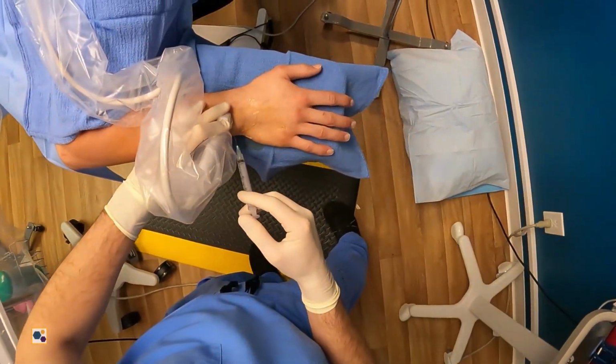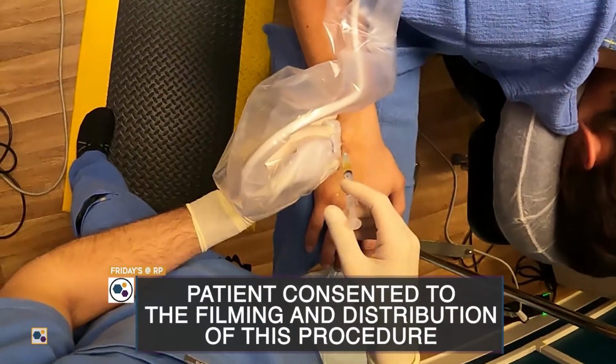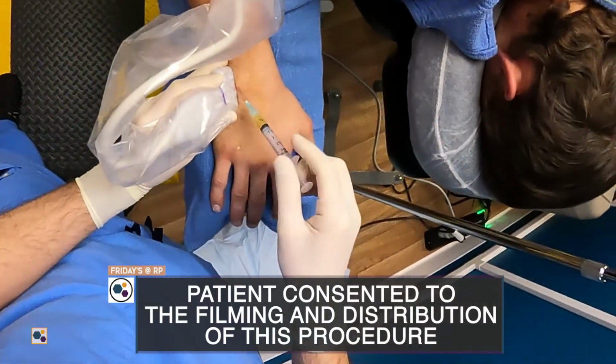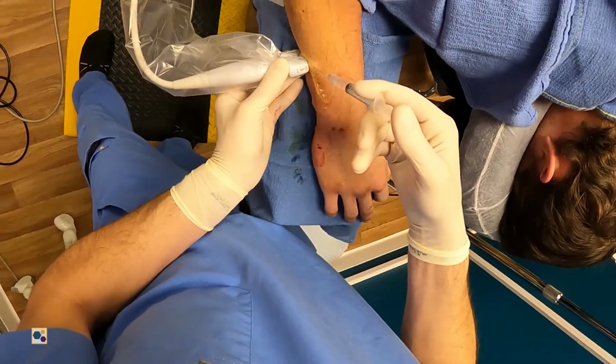And then lastly for him, he was having some right-sided wrist pain that actually was more of a traumatic injury. It's not more of a chronic degenerative thing, but he basically took a fastball right to the inside of the wrist. And so from that, we suspect that he had a little bit of ligamentous damage in that interosseous ligament, that membrane between the radius and the ulna, along with some of the ligaments on the medial aspect of the wrist. And so under ultrasound guidance, we hydrodissected some of the nerves in the area that could have been contributing to some of his pain. And we injected along the ulna, along with the ligaments for the medial aspect of the wrist. Again, recreated a lot of this patient's pain, so we're really, really excited for that.